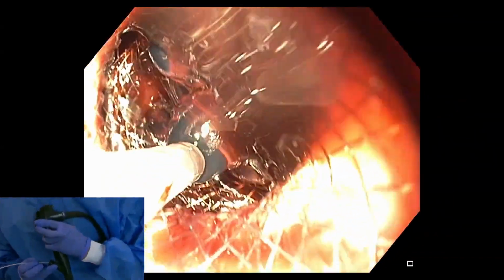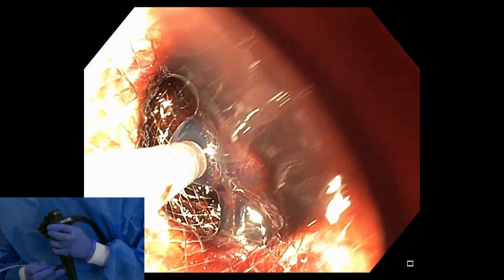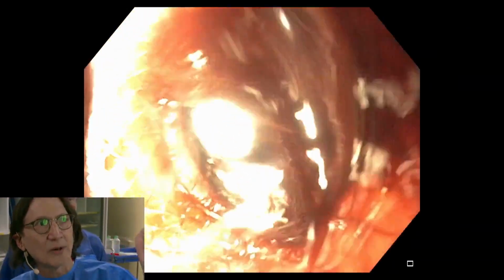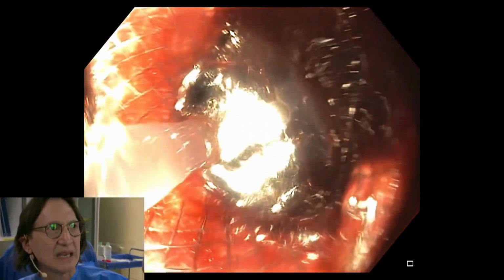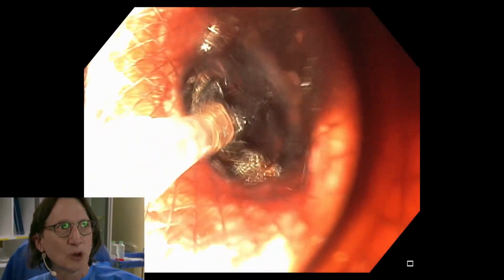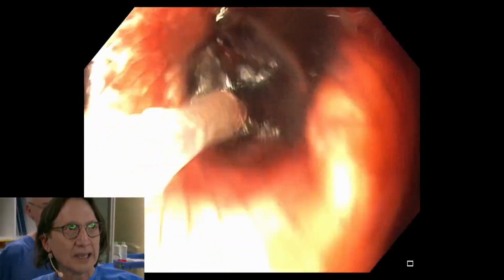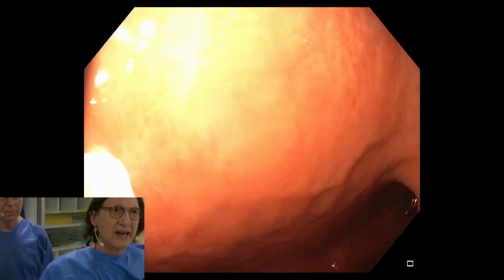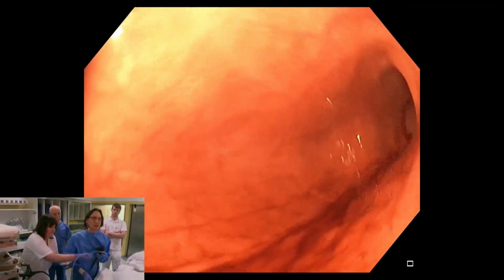So I think this is a beautiful modality, and obviously something that you want to use if you have any bleeding. But I think the question is whether it may also help with regenerating after drainage, regenerating the tissue, restoring the normal epithelium. So I think we can just pull out now. And I'll pull out the gas, and we're done with this procedure.